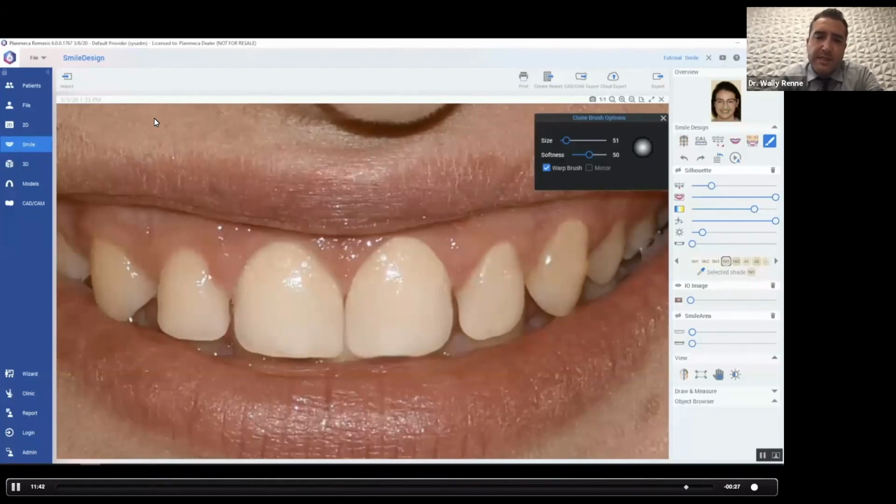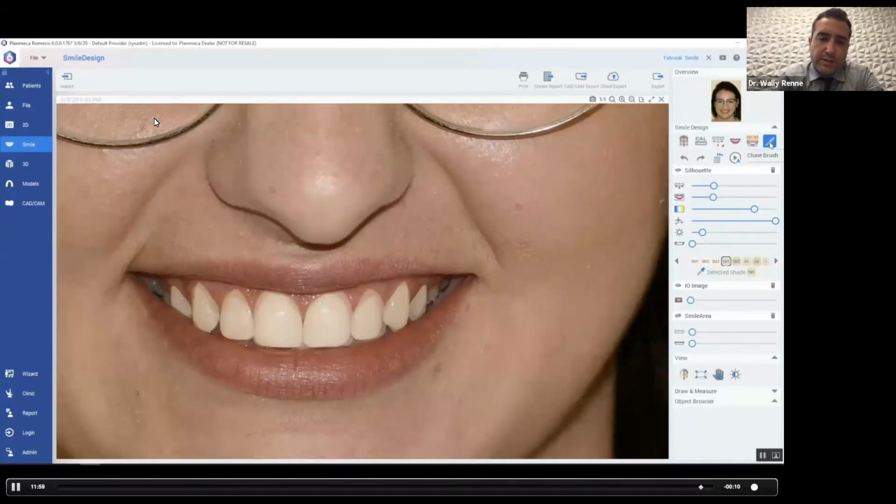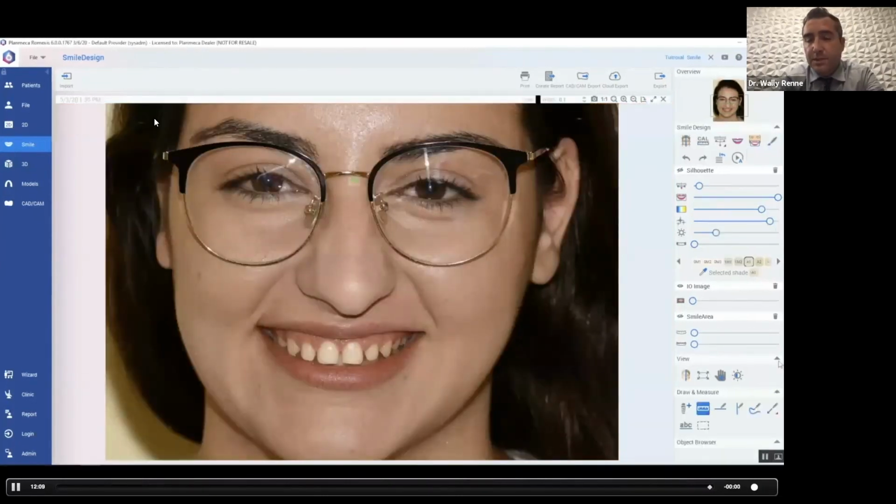And so now I'm just speeding this up so I can show you guys we're morphing the gingival architecture. We're mirror imaging line angles of contralateral teeth. We're cloning things, and we're zooming out because we're so zoomed in right there. We're at 50 times mag pretty much. We're way too close. And so now I'm overlaying our silhouette, which had my proper proportions that I wanted the smile to be. And I'm sculpting the teeth to match the proportions. And I'll show you why we do this in a minute. It's because we could get an ultra realistic look at the teeth.